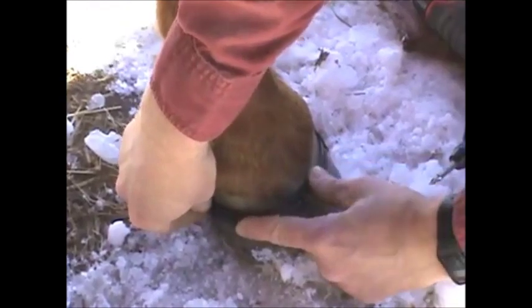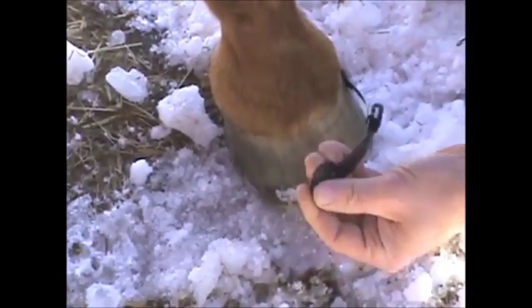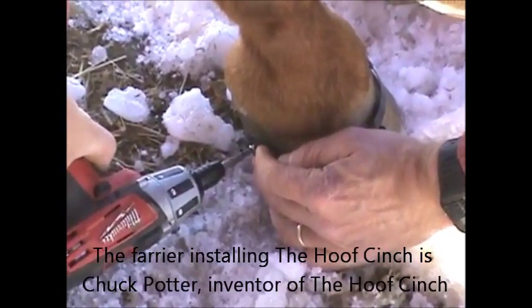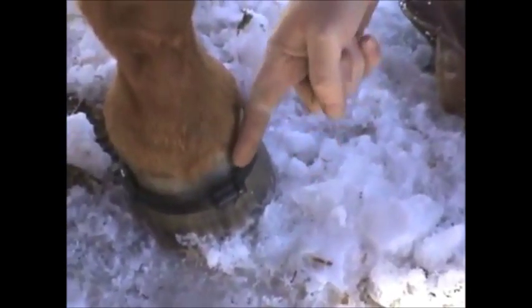There's the first one. Come around and we'll find the placement. The band's on. Sometimes the band won't lay flat against the foot and that's fine because it eventually will as the hoof changes shape. Now we're going to put the hold-down clamp on. Keep it in place and then we'll put the rest of the screws in.